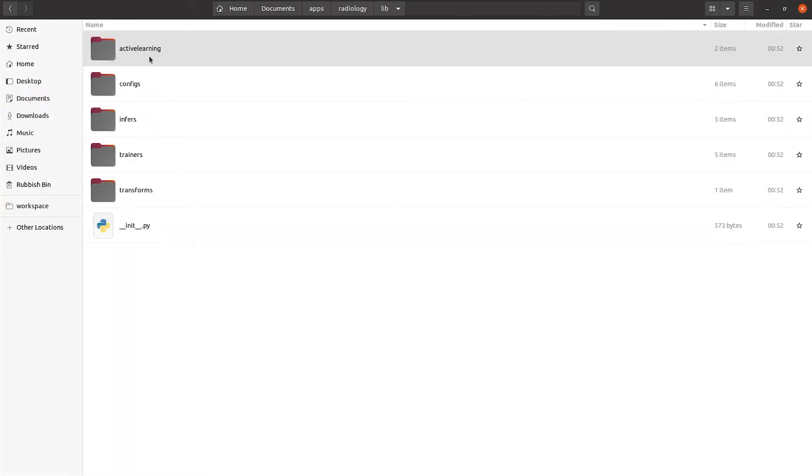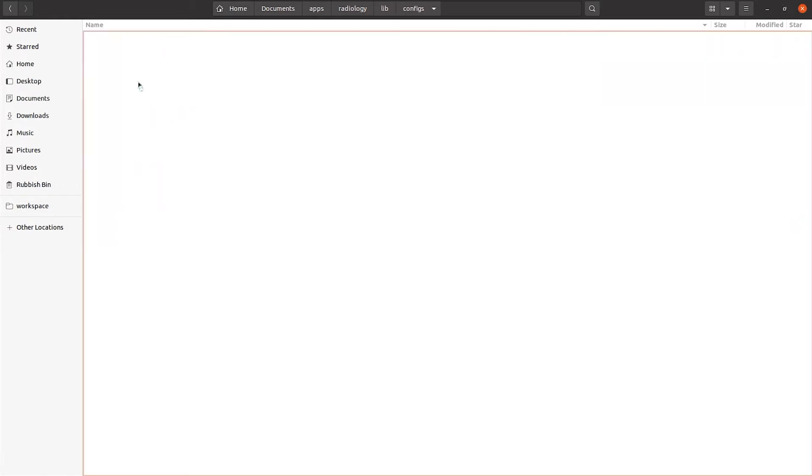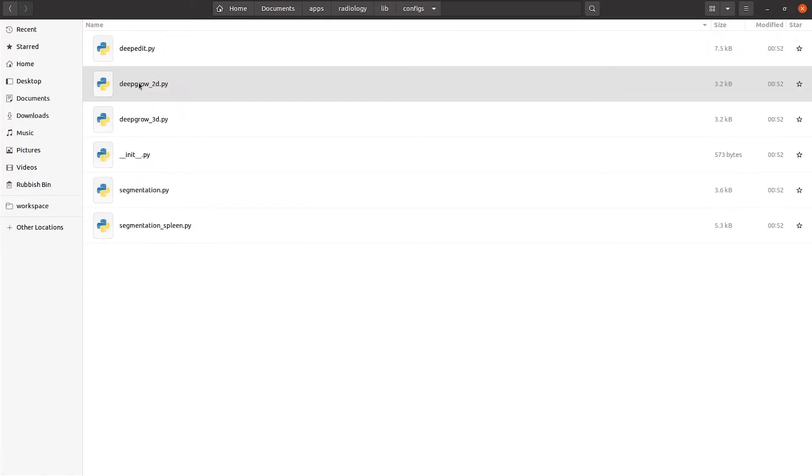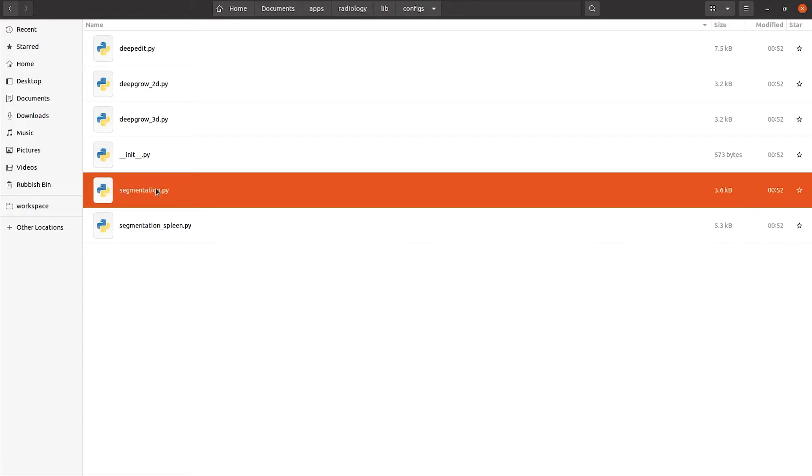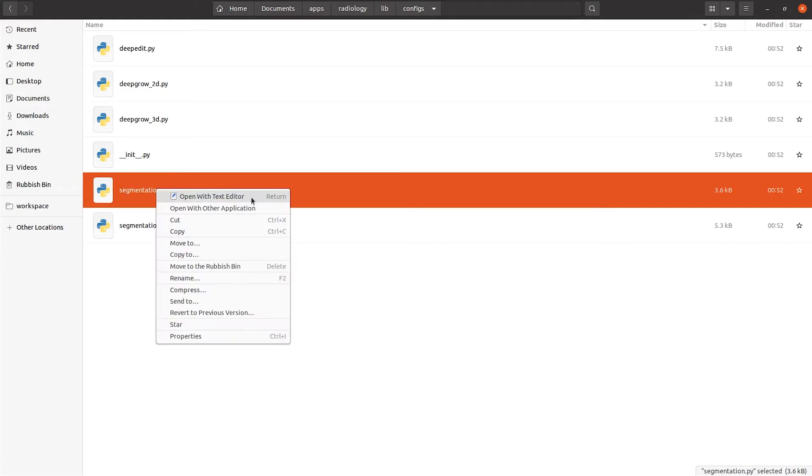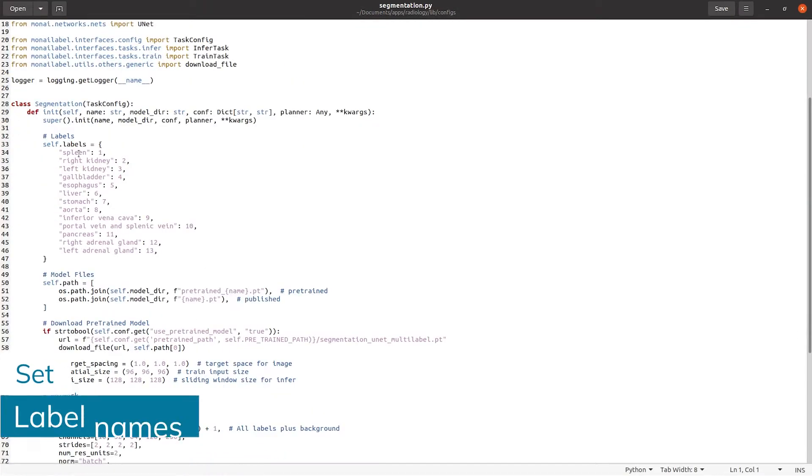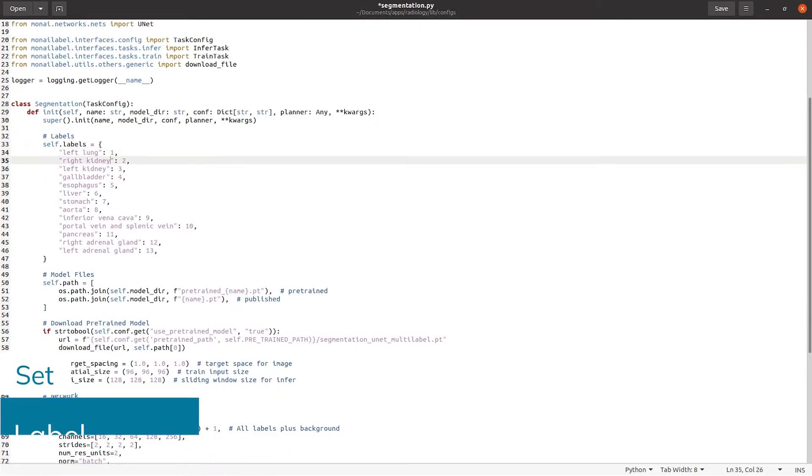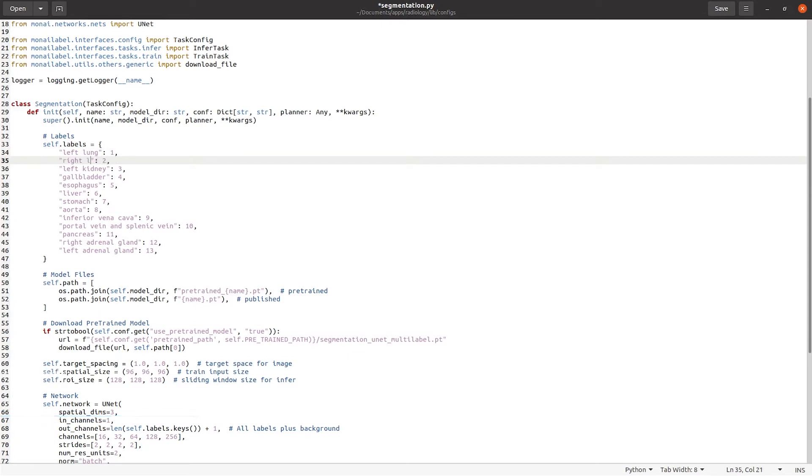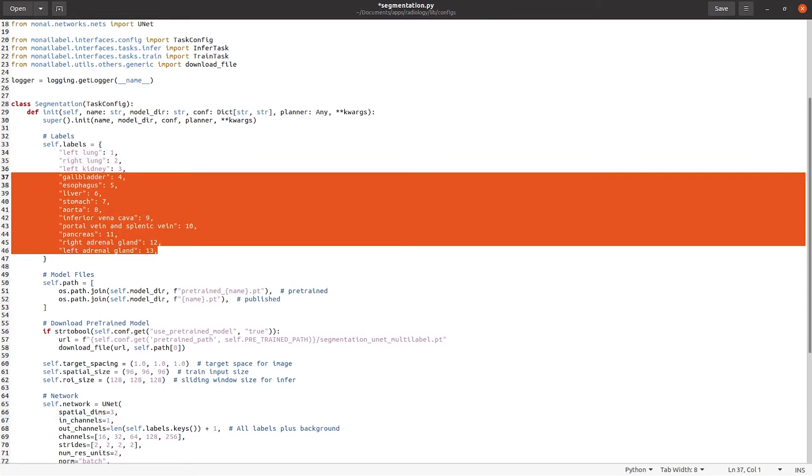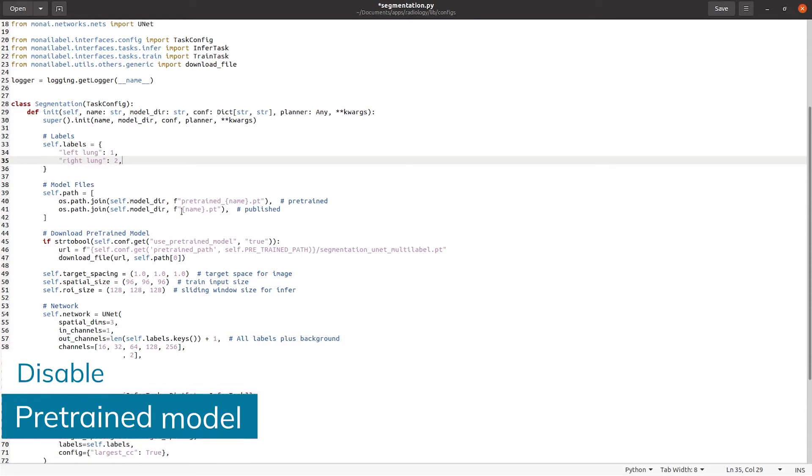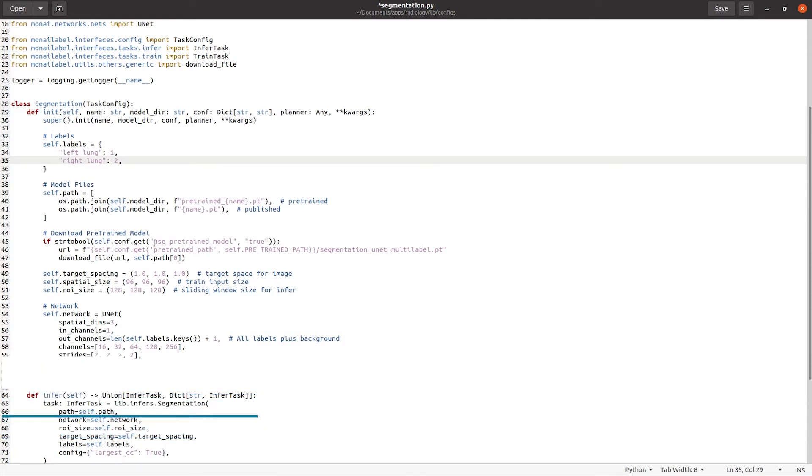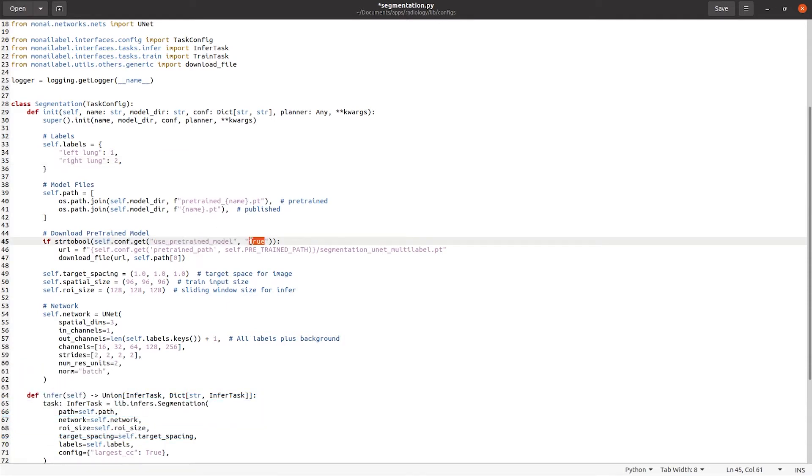The Radiology app is composed of three models: the DeepGrow, DeepEdit and the Segmentation model. Although we used the Segmentation model for this video, you could follow the same steps for the DeepEdit model. Here we set the label names and set to false the pre-trained model. Setting the pre-trained model to false is mainly because we are training from scratch and also the default pre-trained model works for a different number of labels.